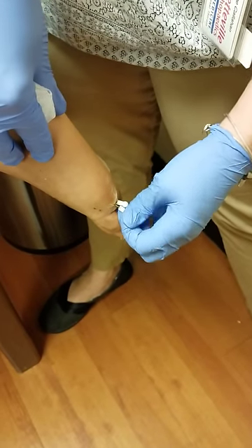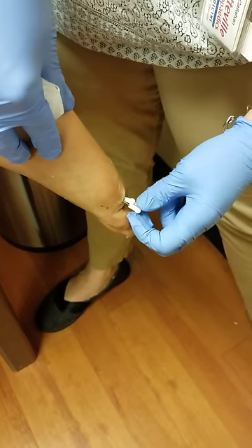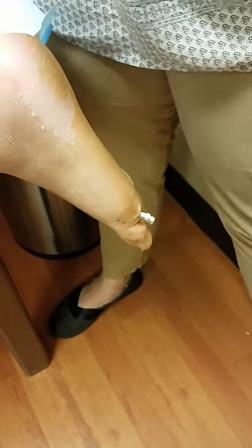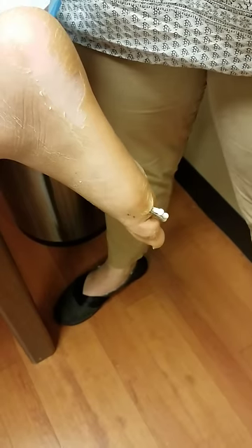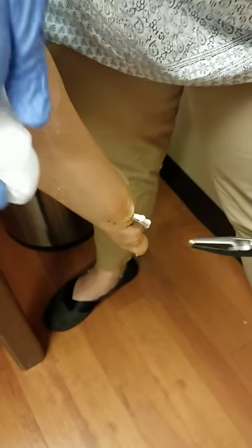She's probably worked them around enough. After they're healed really well, there's times you take the cast off and the pin just kind of comes out with it. It's already started coming out a little bit, and you probably didn't feel it a whole lot, but as I was taking that cap off, it came out about that far. You didn't even feel it coming out.